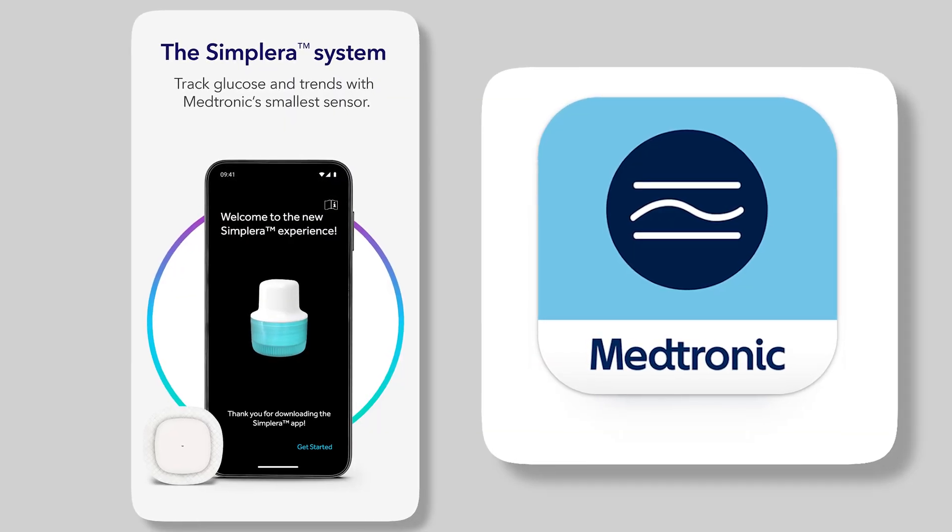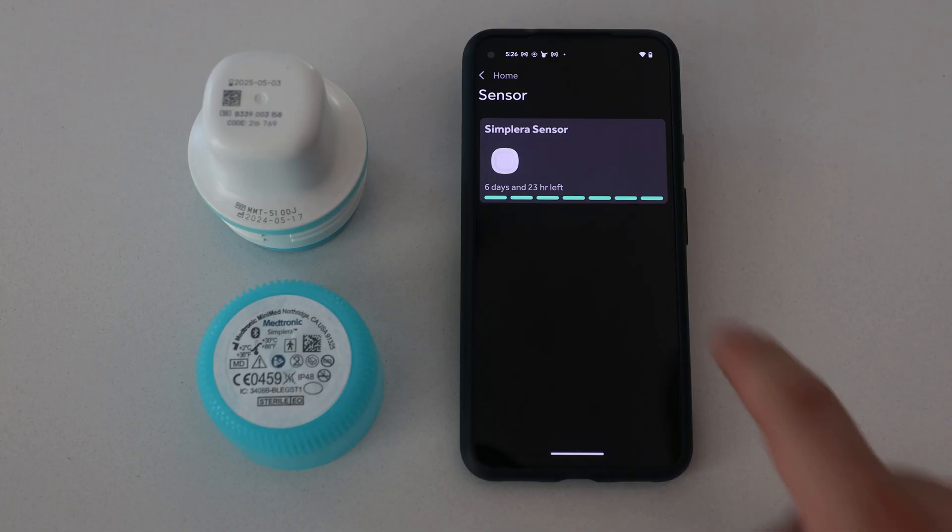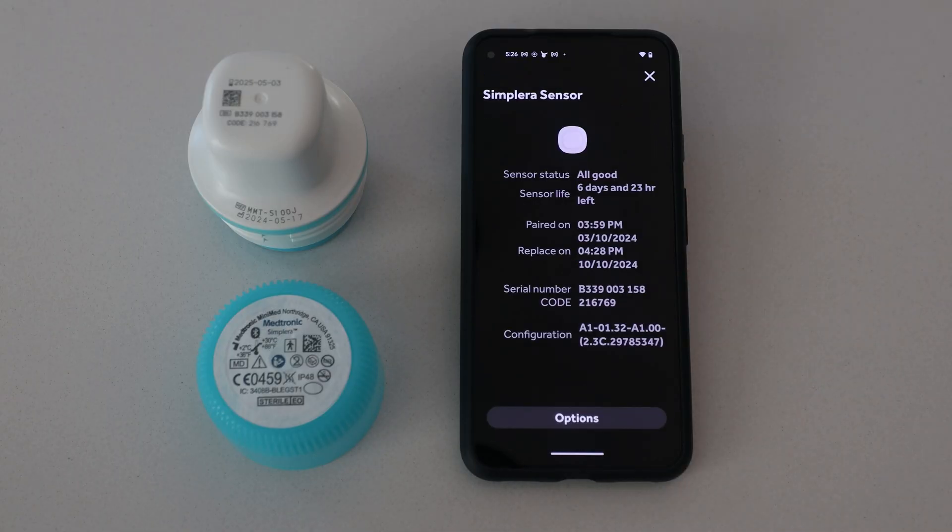The first thing I had to do in order to get readings was use a second phone, because my phone is registered in the U.S. I'm using a Google Pixel 5a registered at a different address so I'm able to use the Simplera app. I had to create an account in the country where my phone was also registered, and now I'm on the screen where I can set this up.